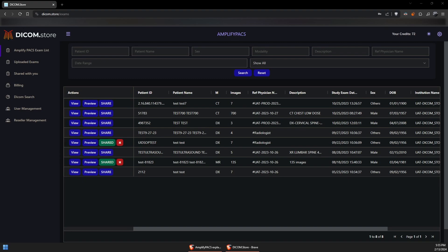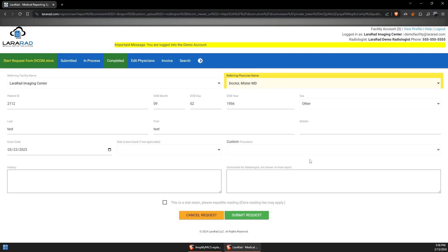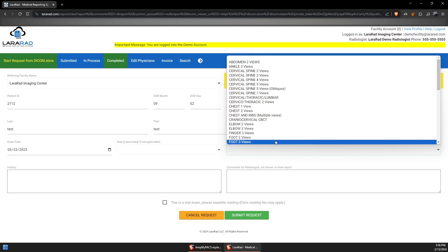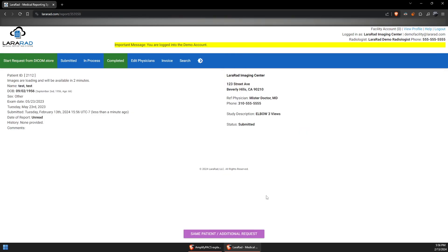The process for submitting images to your radiologist with an Amplify Pax subscription is very simple. Go to Dicom.store, locate the exam, click Share, and request report on Lara Red. Click Continue, complete the required fields, and submit your request. And you're done.